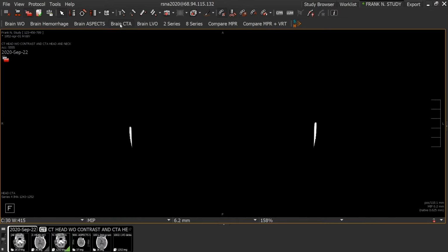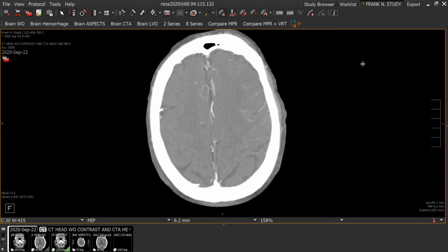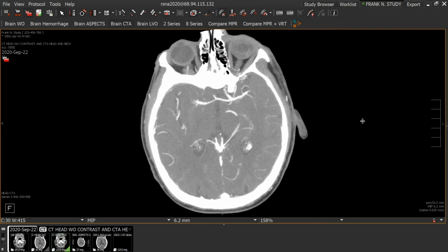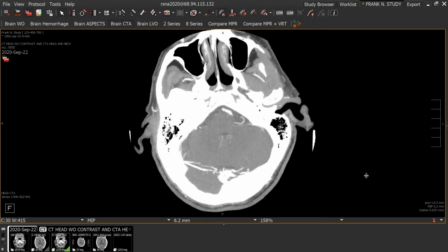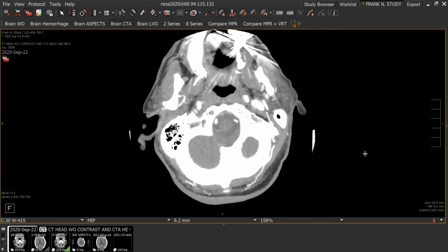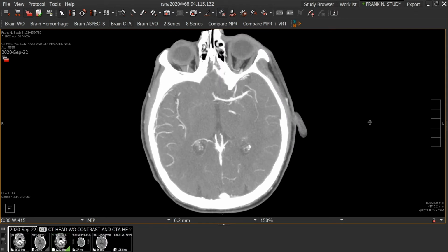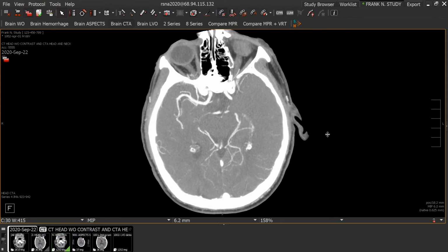Those are great points. Moving on, finally, the radiologist decides to scroll through the CTA, again avoiding bias. First focusing on the MIP images to evaluate for possible large vessel occlusion or LVO. The radiologist notices an abrupt vessel cutoff on the left concerning for LVO. Then they decide to review the Siemens AI RAD Companion results, which confirm the occlusion.